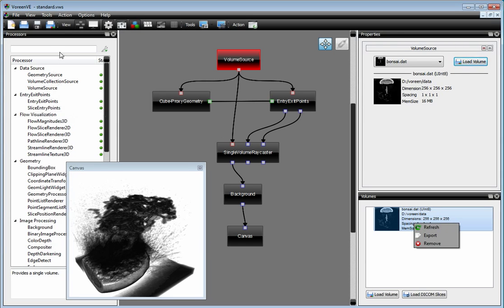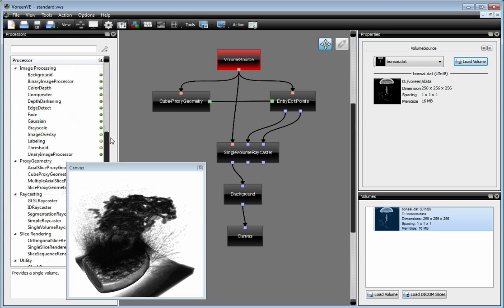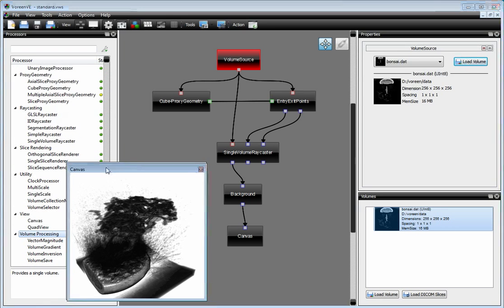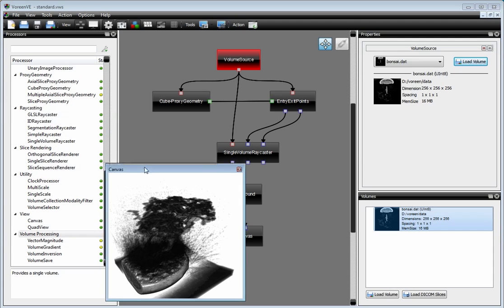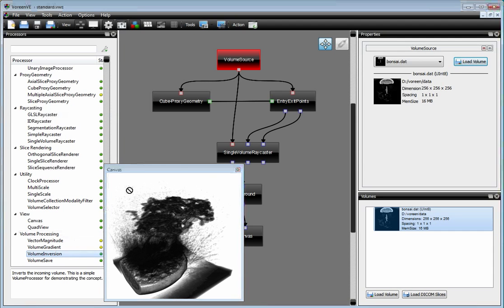We also have some volume processors in here. They are down here. These processors allow us to do simple operations on volumes. For example, we could use a volume inversion processor.